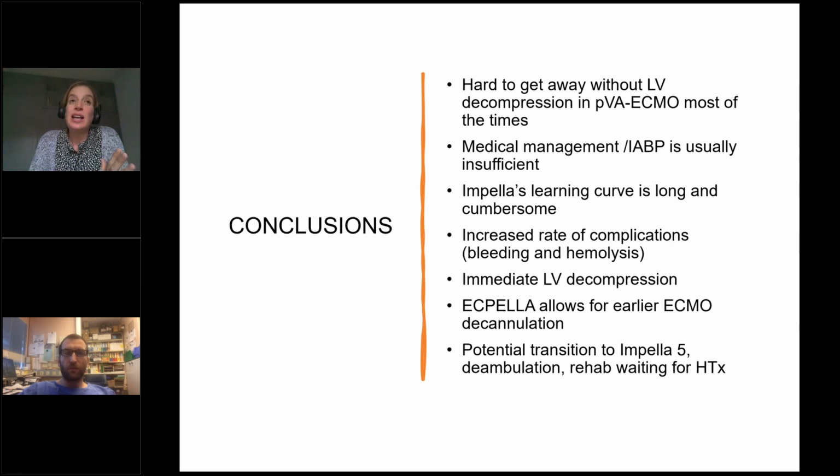And we, in our cardiothoracic unit, are very pro using PA catheters for the postoperative care of cardiac surgery and most of our patients. So we are very familiar with PA catheters, but definitely you don't need a PA catheter if you're an expert echocardiographer to manage these patients. Yes.